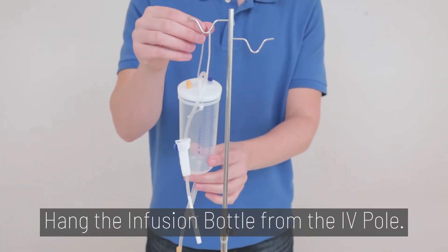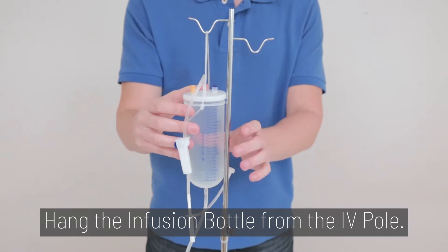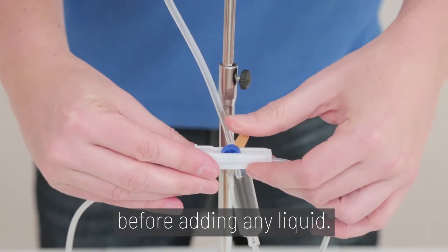Step 3. Hang the infusion bottle from the IV pole. Make sure the roller clamp is closed before adding any liquid.